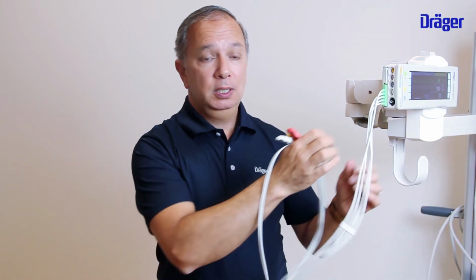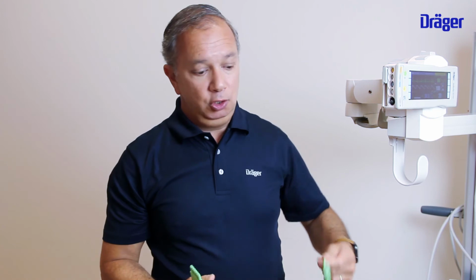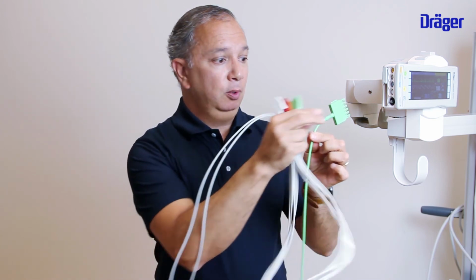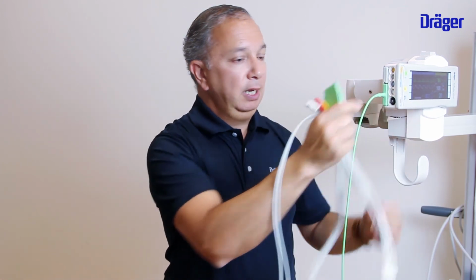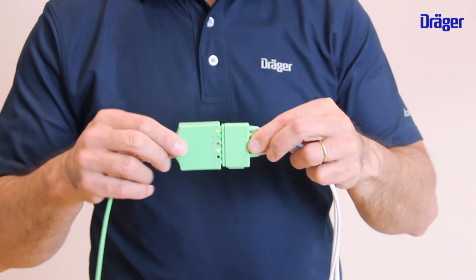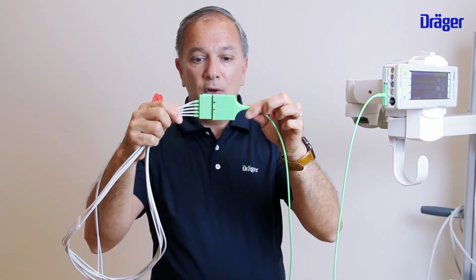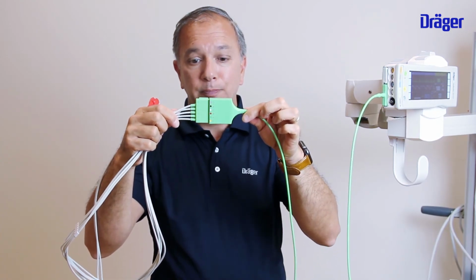The second option is by using your extension cable. So what you do now is you connect your extension cable into the monitor and you connect your ECG connection cable to the connector of the extension cable. So now you have a length of 3 meters instead of 1 meter.